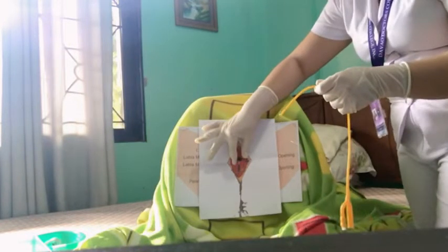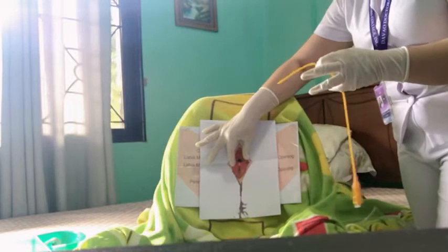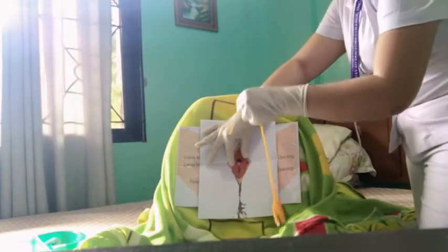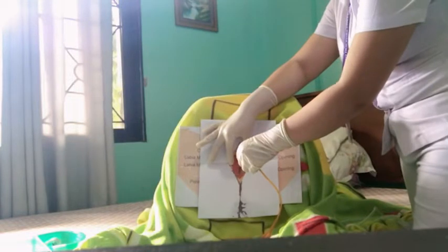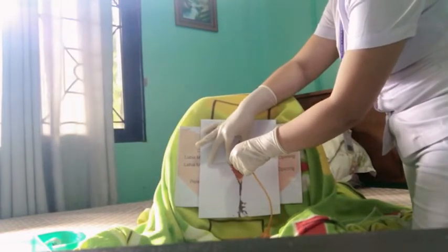Okay, receptacle here. So separate and pull up gently, separating the labia minora. By separating it, the area surrounding the meatus will provide visibility. So insert the catheter into the meatus for 2 to 3 inches or until the urine begins to flow.